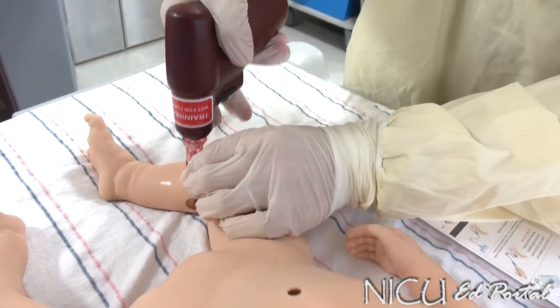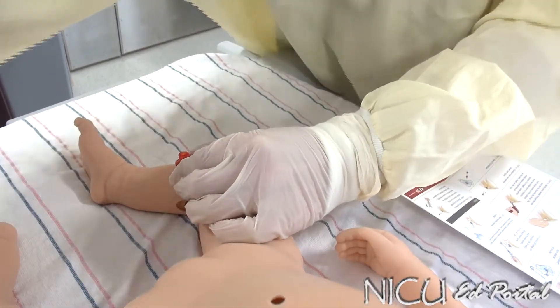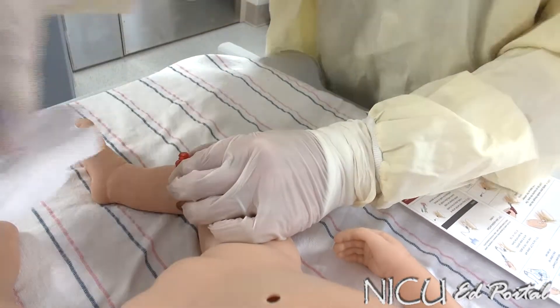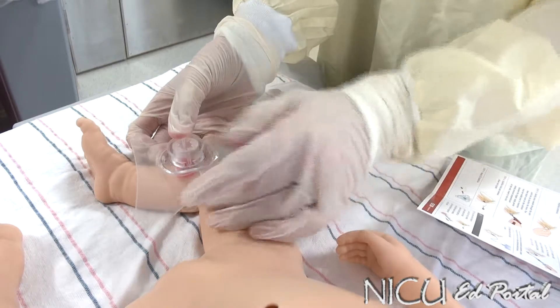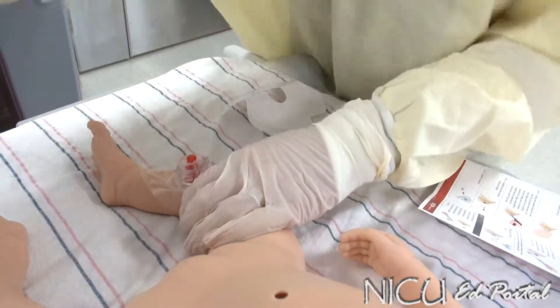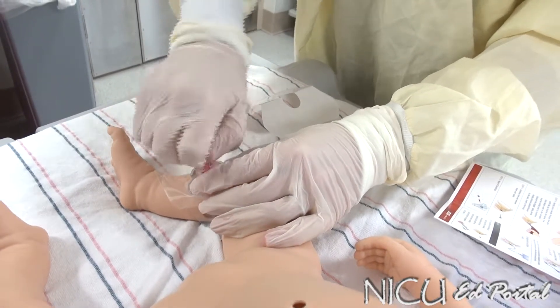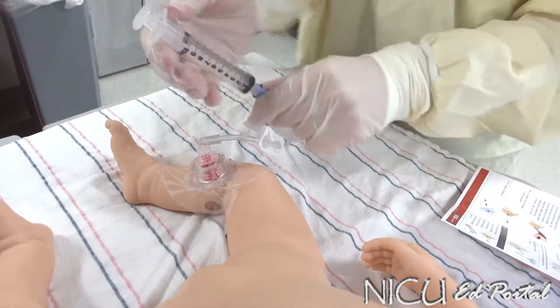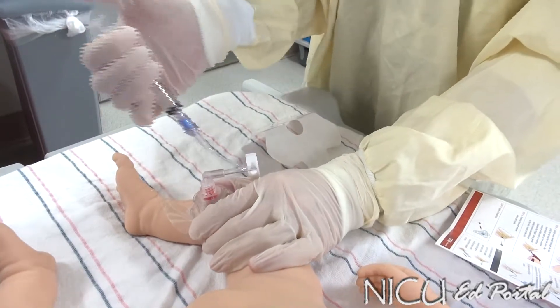At this point, I stabilize, remove the drill, unscrew the insertion needle, and place it into a safety. Then I secure it, or ask someone to secure it for me. I connect, and first I aspirate. And then, if this were filled with saline, I could flush in saline, or my medication.